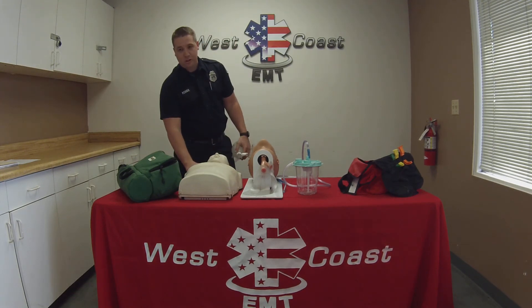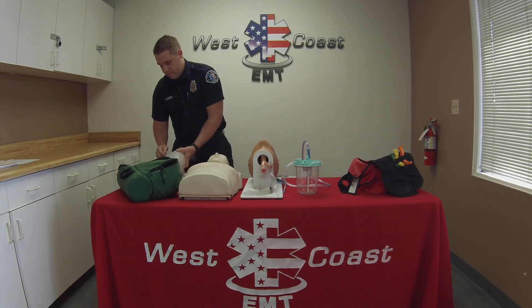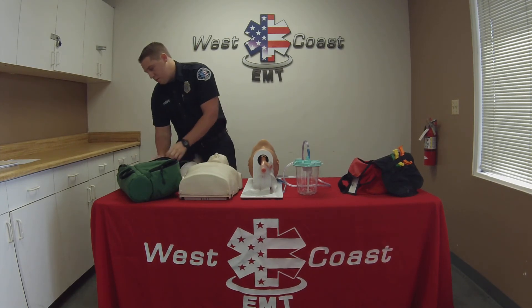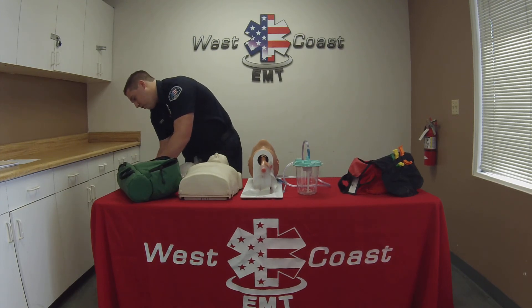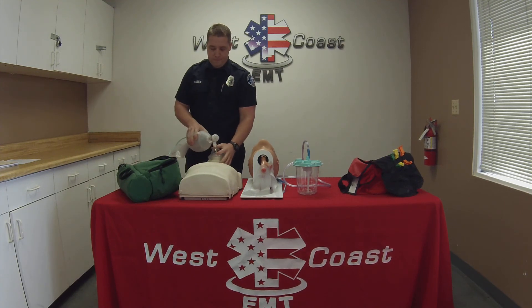I'm then going to recheck to make sure I still have a carotid pulse, and I'm going to hook up my patient's high-flow O2. I'm going to set my regulator to 10 to 15 liters per minute and continue ventilating the patient, giving one breath every five to six seconds, or about 10 to 12 breaths per minute.